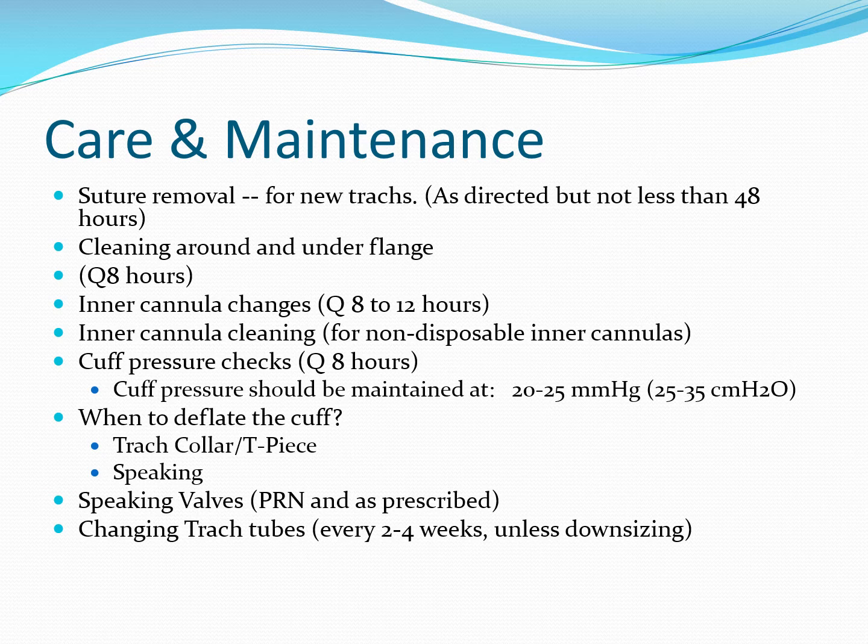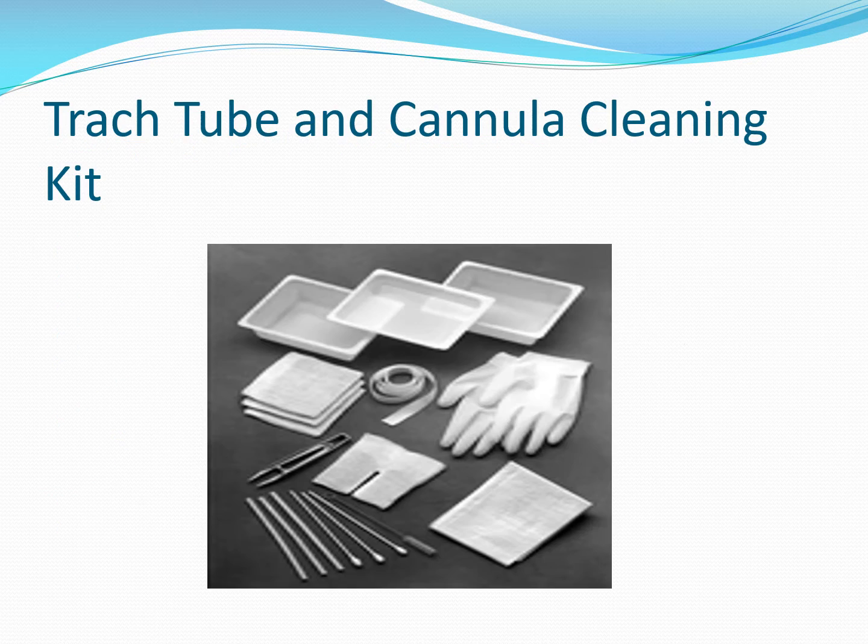Speaking valves, we'll talk a little more about them. Changing tubes is about every month, sometimes more frequently, depending upon, again, the particular clinical circumstance and patient.